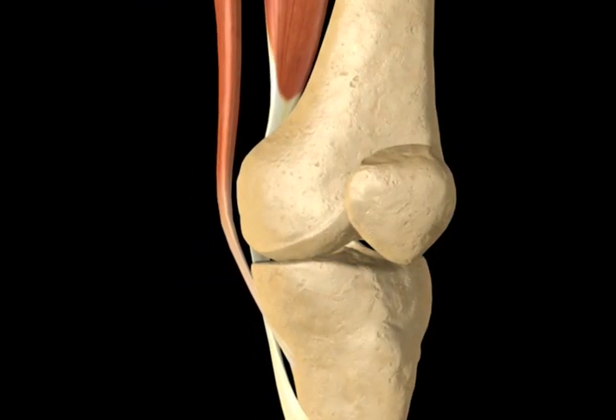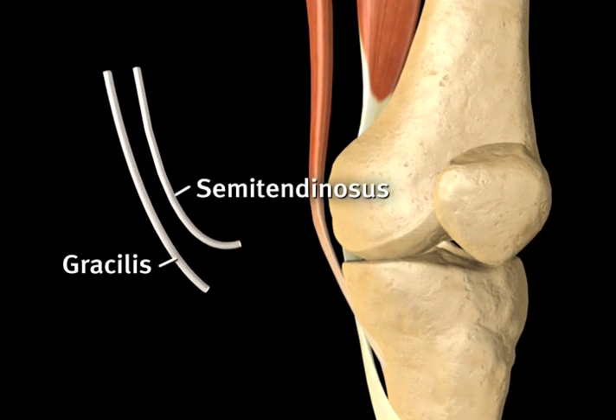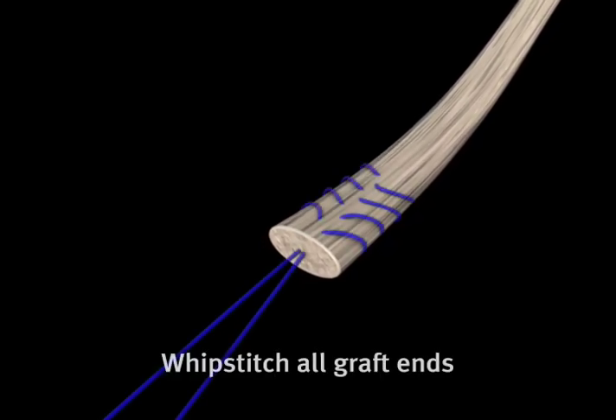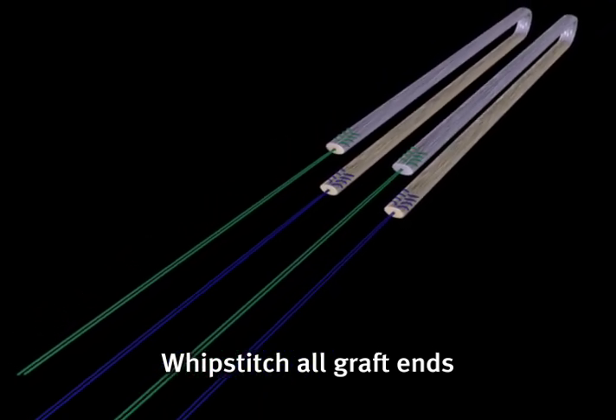The procedure begins with the harvesting of the hamstrings or preparation of an allograft. Once the hamstrings are harvested, each end of both graft strands are secured with a number two non-absorbable suture in a whip-stitch fashion.